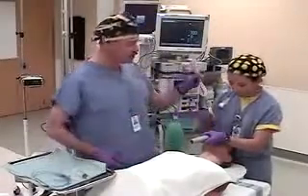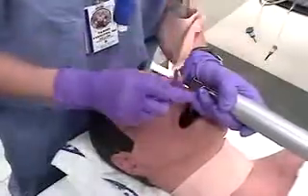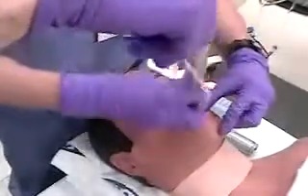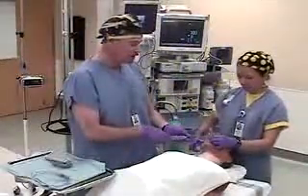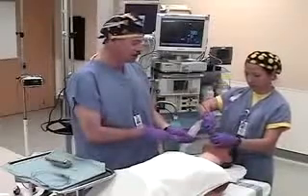The bougie is then inserted approximately 5 centimeters into the esophagus. The laryngoscope is then removed. The Proseal LMA is then inserted using standard insertion technique, at which point the cuff is then inflated to adjust seal pressure.